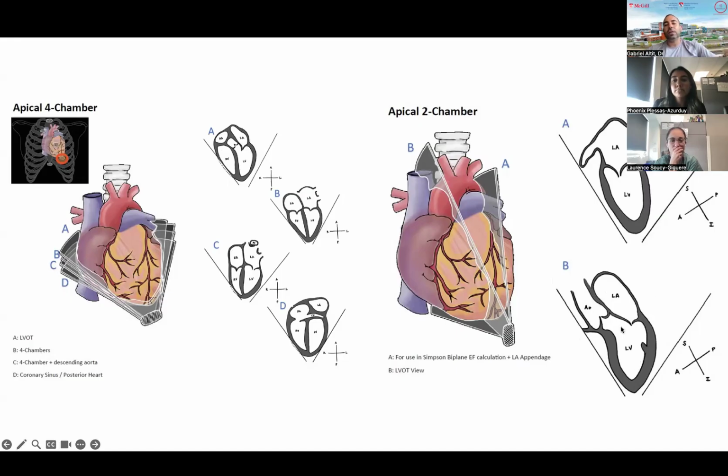And that's really a good view to see the continuity between LA, LV, your fibrous continuity between the aorta and the mitral valve, which are abutting each other, very different than the RV, which doesn't have this fibrous continuity. So you have a conus below, or an infundibulum before your pulmonary valve. So it sits on a muscle sleeve. And so here you see that there's mitral continuity. You see that the LA empties into your LV and eventually pumps into your aorta.